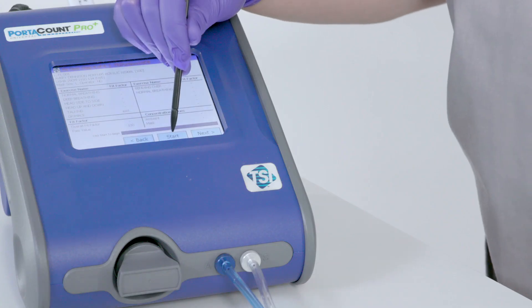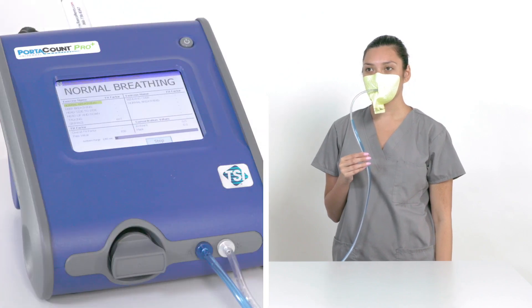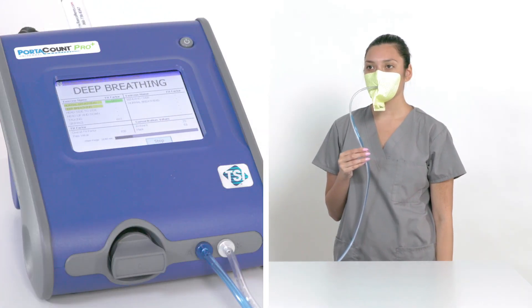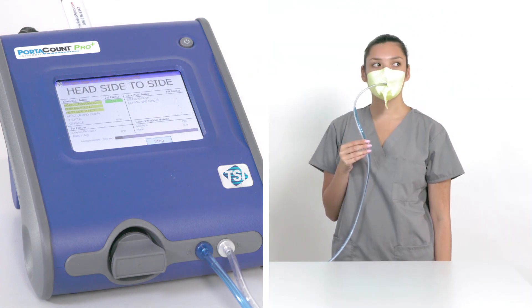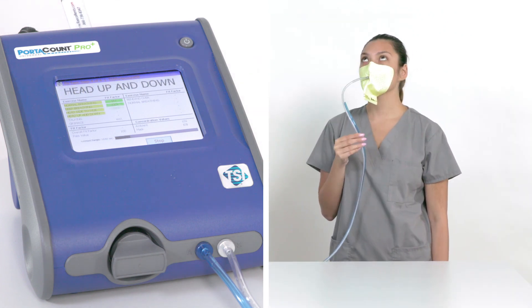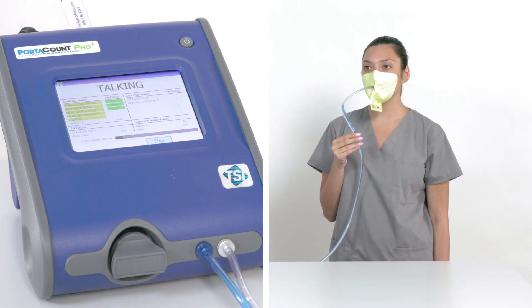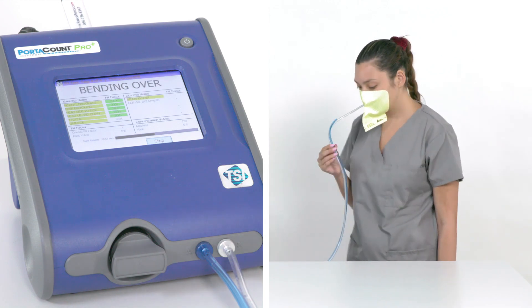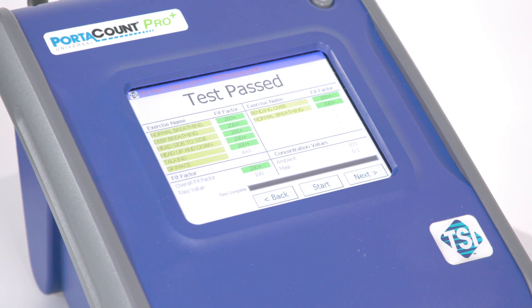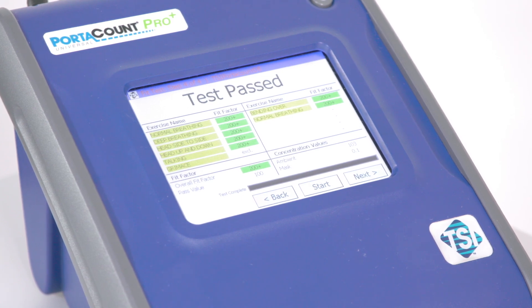The test subject will then be led through the eight fit test exercises: normal breathing, deep breathing, moving the head side to side, moving the head up and down, talking, grimacing, and bending over at the waist. Check the score after each exercise. Once the test movements are complete, the machine will process the subject's score and provide a pass or fail rating.